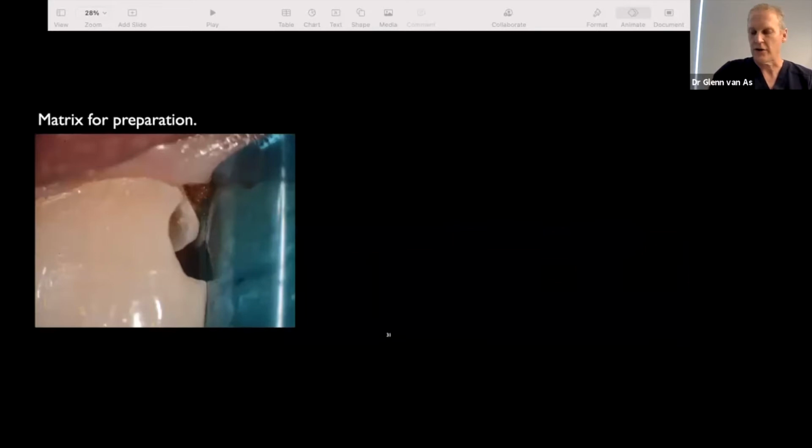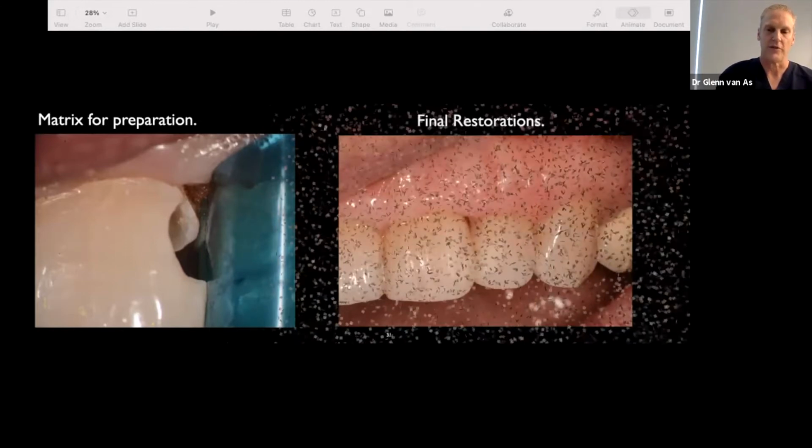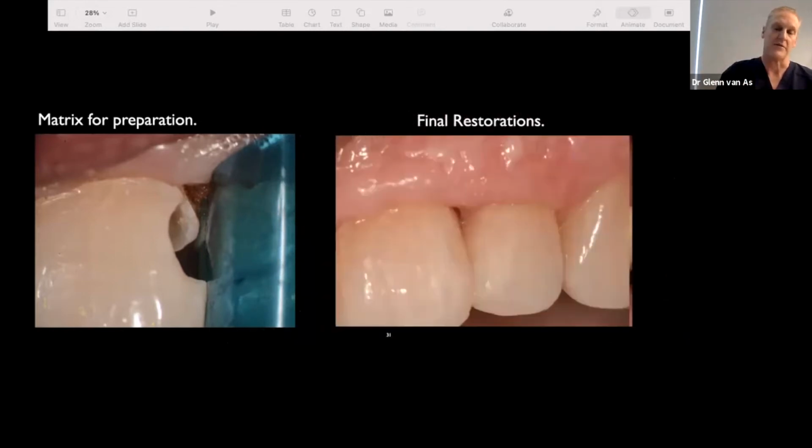And I know across North America, in other areas outside of Canada, that people floss, but they say 8% of people floss in British Columbia. And I know that bleeding interproximal tissue is never an issue where you live, but unfortunately it is an issue here in Canada. So here are the restorations. The tissue will creep back immediately, and you've been able to control those restorations and control the tissue in that area very easily by using the diode laser. So we use this routinely, particularly in class 5s, where the caries is going underneath the soft tissue.